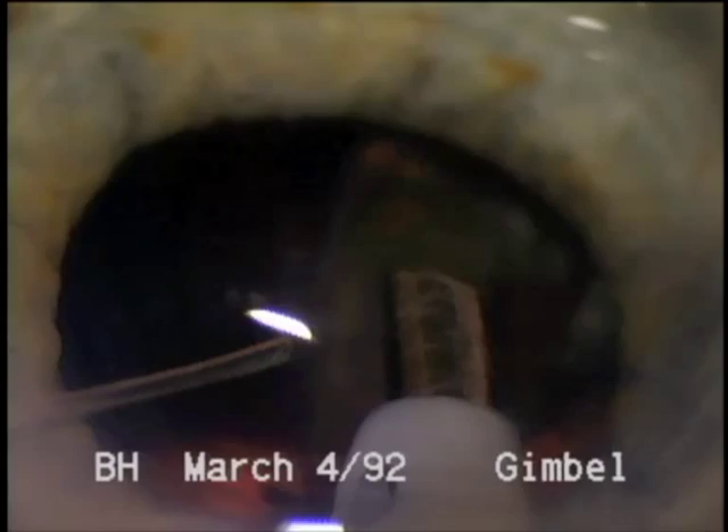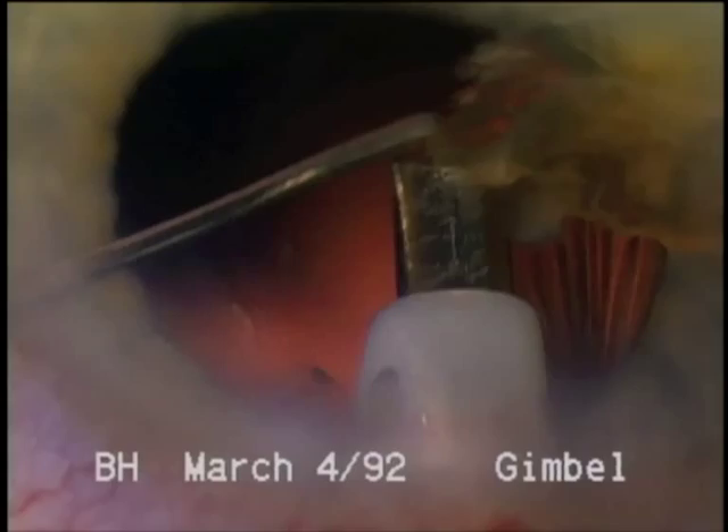As we conclude the case, we realize the advantage of phacoemulsification even for the very dense brunescent nucleus, where the intact continuous curvilinear capsularexis has been maintained for in-the-bag placement of the implant, and this dense lens has been removed through a small incision.